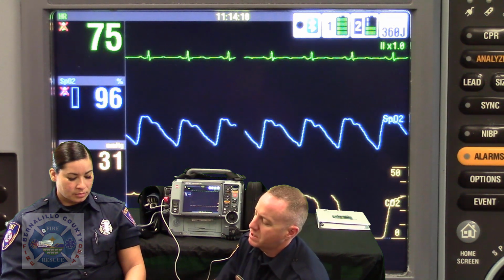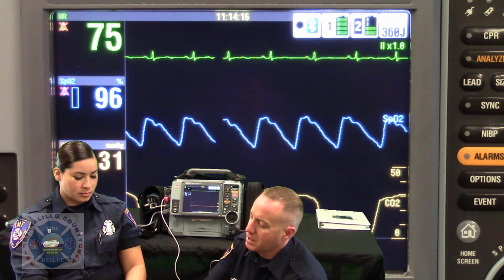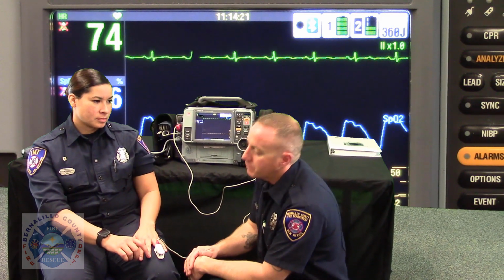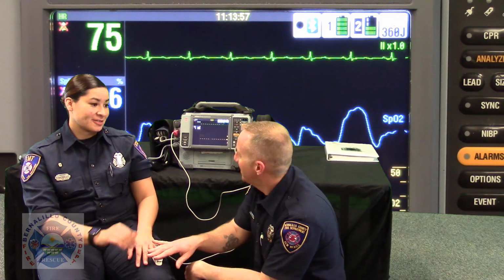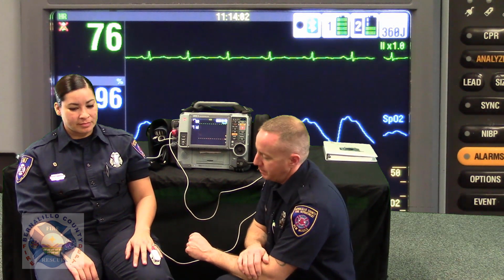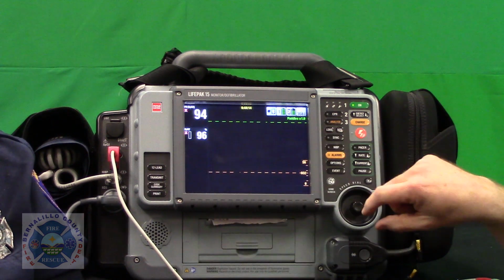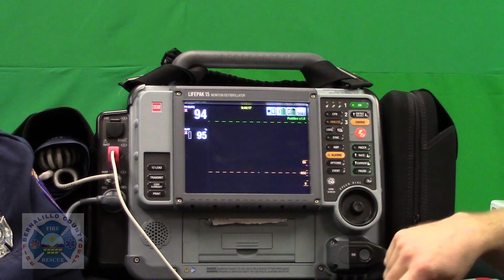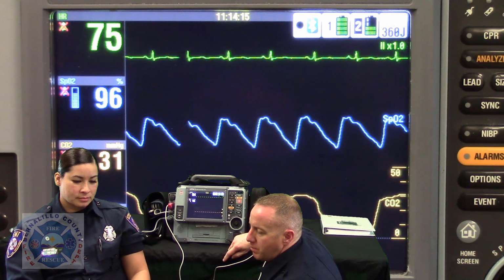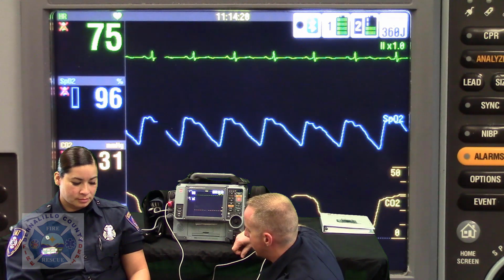I'm going to place the pictogram with the nail bed upright, and then I'm going to assess and protect for any ambient light which might negatively impact my reading here. And also remove anything that's in the way, like nail polish and things like that. It looks like we have a good bouncing graph on the left side. We have a good pulse and a good saturation, and I also want to verify at the radial site that my beats and the monitor's beats are along with each other, the good cadence, which they are.